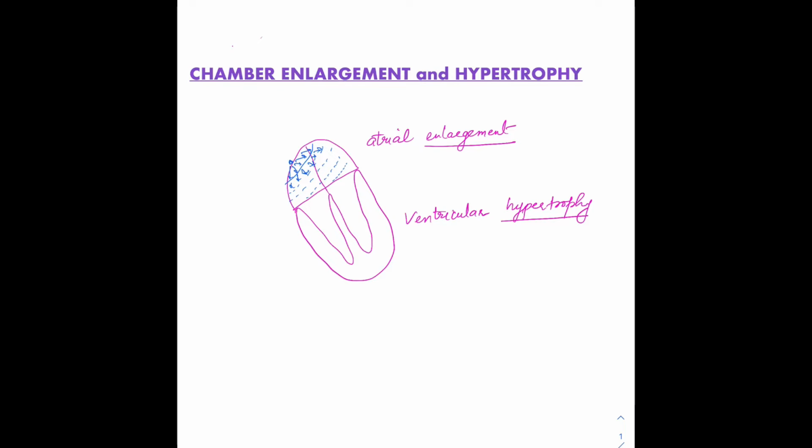hypertrophy. The P wave changes in the ECG do not reflect the thickening or hypertrophy of the atrial wall, but rather an increase in the dimension of the atrial cavity. Okay, so the P wave will basically represent the increase in the dimension, not hypertrophy. And that is mainly related to the way in which the impulse is conducted, which is circumferentially. So we'll be talking about the distance this way.